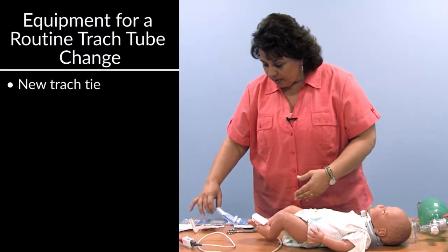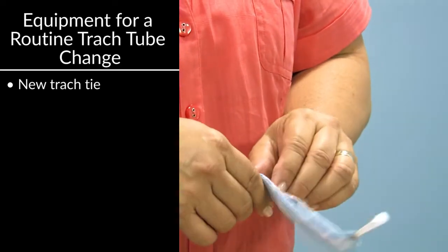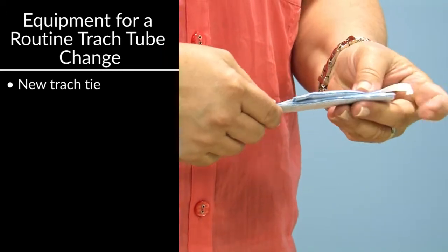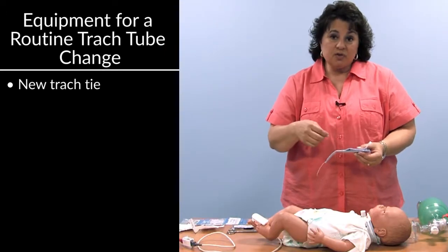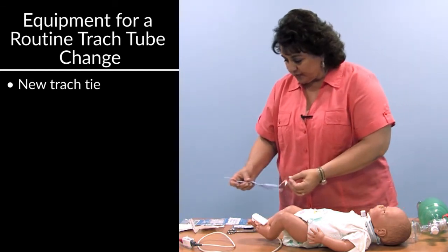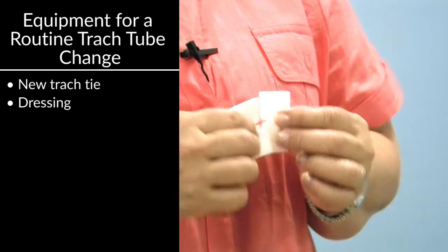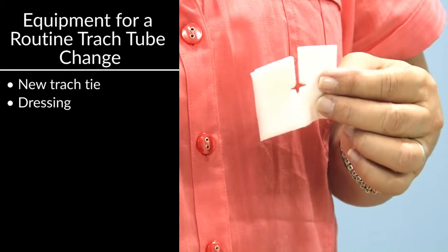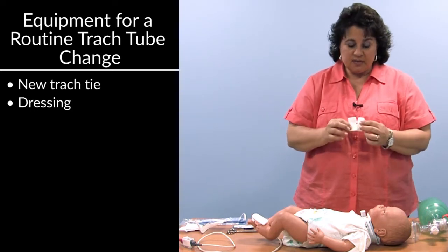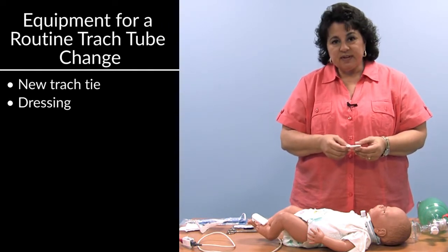We want a new trach tie to help hold the tracheostomy tube in place. This happens to be a Velcro trach tie. There are many brands on the market, and years ago we just had sort of a twill tape or a string that went around the neck, but today we do have nice Velcro holders that are absorbent of moisture from the neck. You will need a dressing to put around the tracheostomy tube to protect and absorb moisture around the tracheostomy tube. Some children, some young adults, some adults choose not to use this.